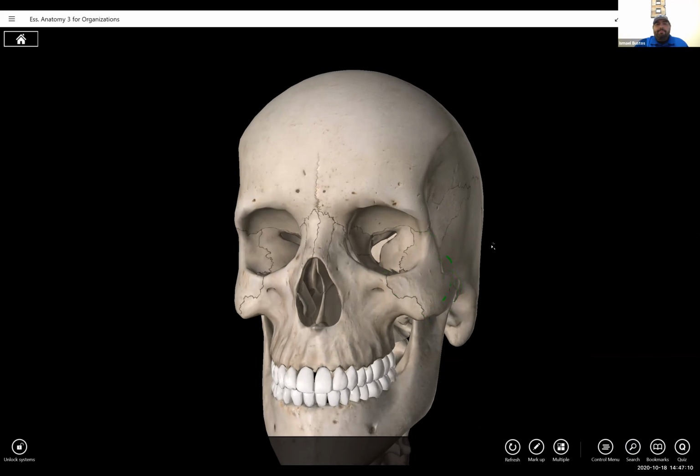Okay. Lefort is kind of more of a different type of fracture you really don't see too often, but it's more of like just horizontal. You'll see horizontal breaks within the orbit itself. So it's not really anything like a tripod fracture. It's more just you'll see like a line coming across there or a line coming across there is more like Lefort fractures. Okay, so but again, go back and look those up. Make sure you understand those type of fractures. But the Waters will best visualize the tripod and the Lefort.